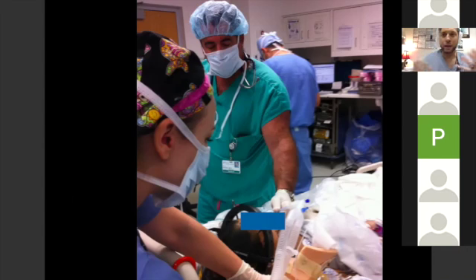So why would an awake technique be better than a sleep technique? Well, the answer is all these muscles in your neck, when you're awake, they're protecting the spinal cord because they all have a tone. But when you induce anesthesia, when you do laryngoscopy, you allow a lot of translation. And if the bony components are unstable, you could potentially have bone hit spinal cord and cause a transection. So sometimes the safest technique is to do an awake technique with an unstable spine.